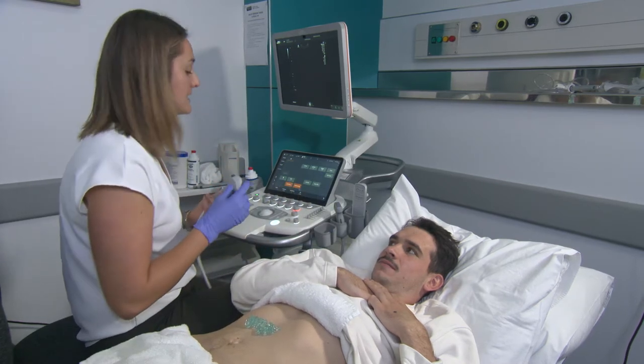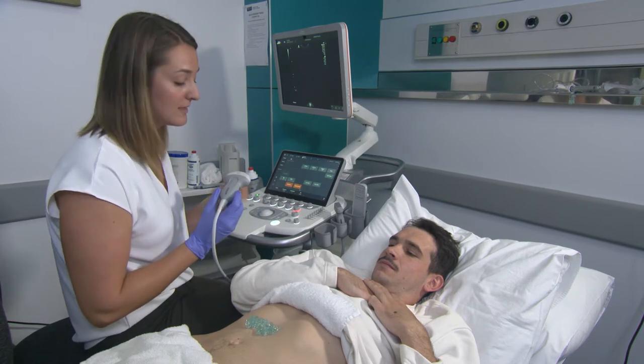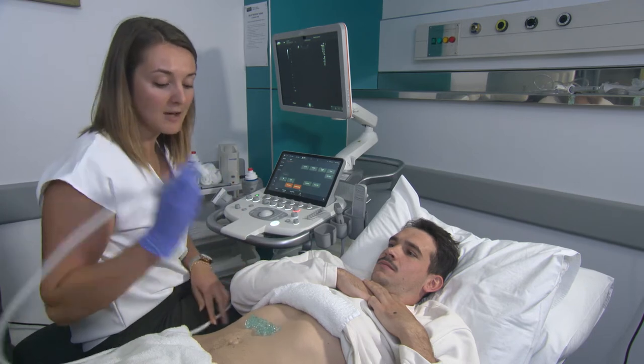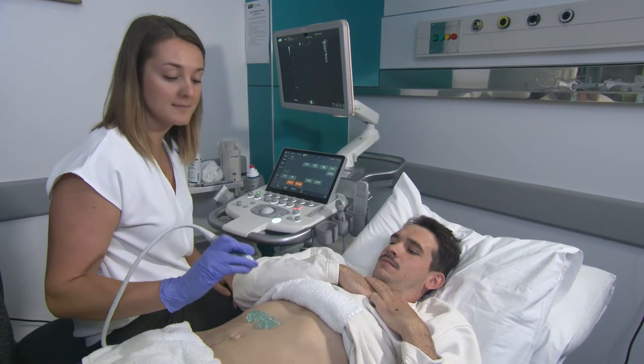The next thing I'm going to do is pick up my transducer. I'm going to be scanning with the Curve 5-1 probe. This is going to allow me to have optimal depth and penetration while I'm scanning.